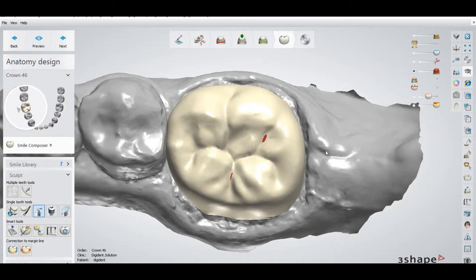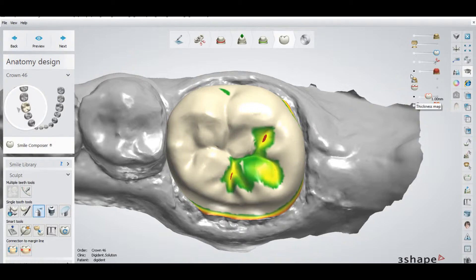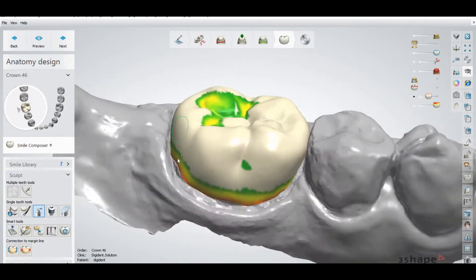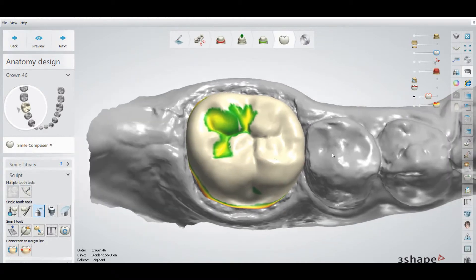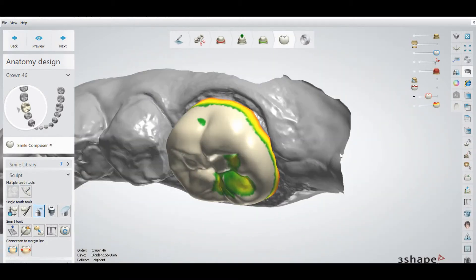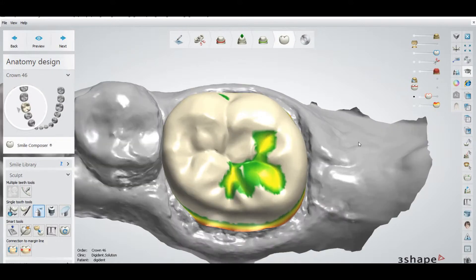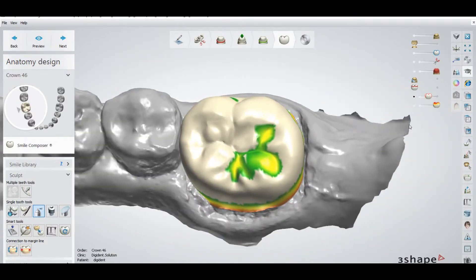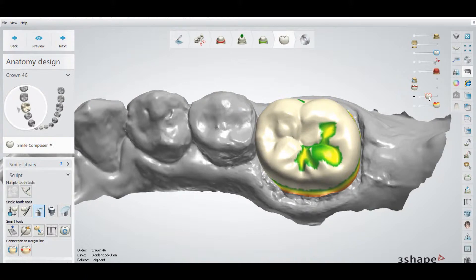There is another option to check the minimum thickness, and it's called the thickness map. From the right side you can see this option. If you press the thickness map option, you can see some colors on the crowns. The thickness map will show you the overall thickness that you have set.